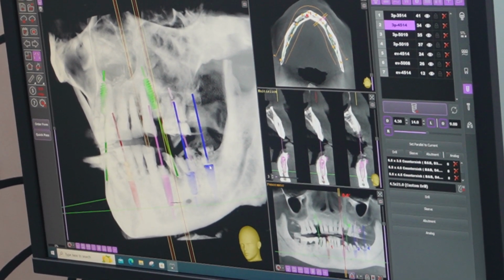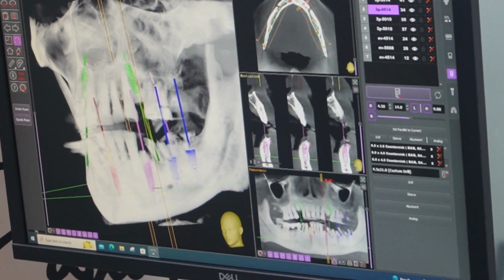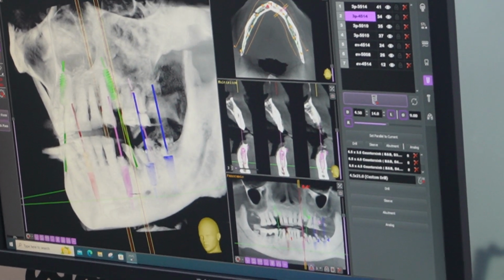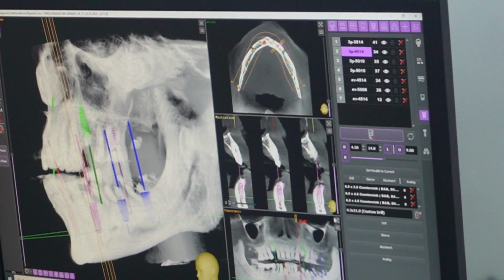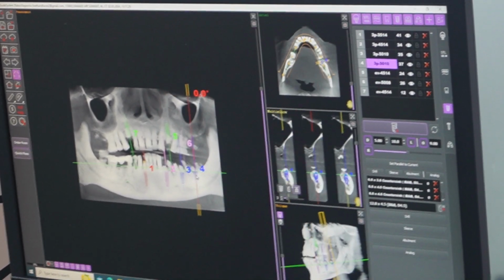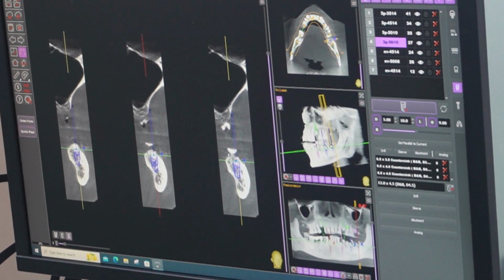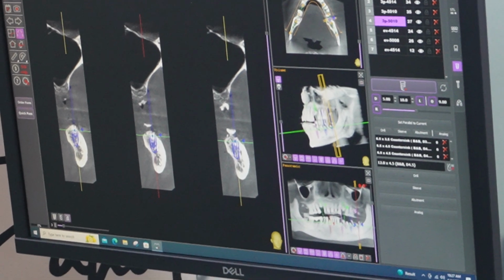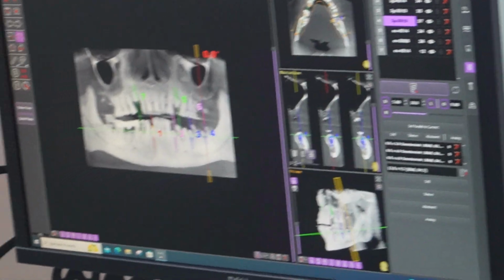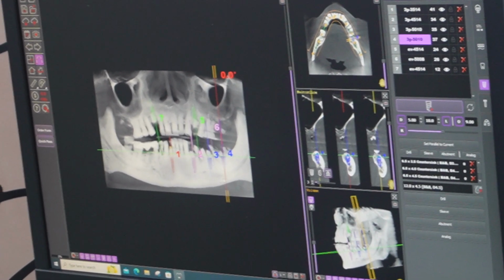Now I know how much bone reduction and how much depth I should place the implant at, and what length and width of implant is available. This is very critical in this area, where there is a nerve going through the bone. So I'll just show you. This black round empty cavity in the bone is a nerve. This is called the inferior alveolar nerve.